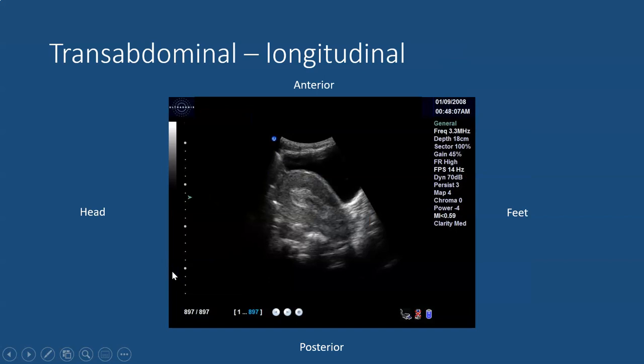This is another view — transabdominal longitudinal — with the indicator towards the patient's head. The probe is placed anteriorly, the top of the screen is anterior, and the bottom of the screen is posterior. The indicator is directed towards the patient's head and the area away is the feet. Here one can see a bladder a bit less distended than our prior image, with the uterus which is more prominent with a thickened endometrium.